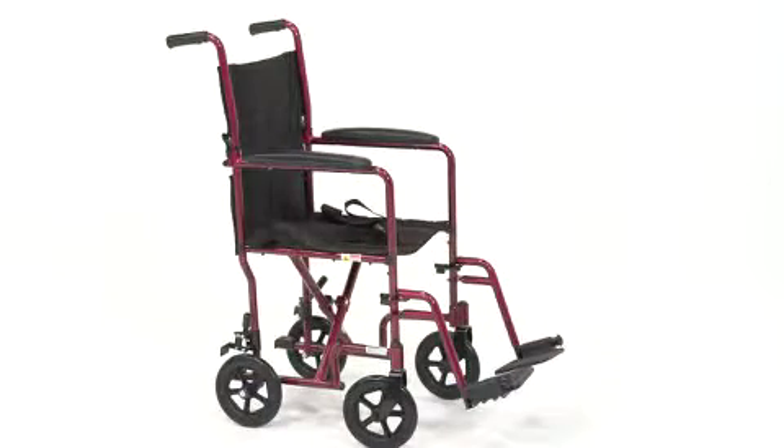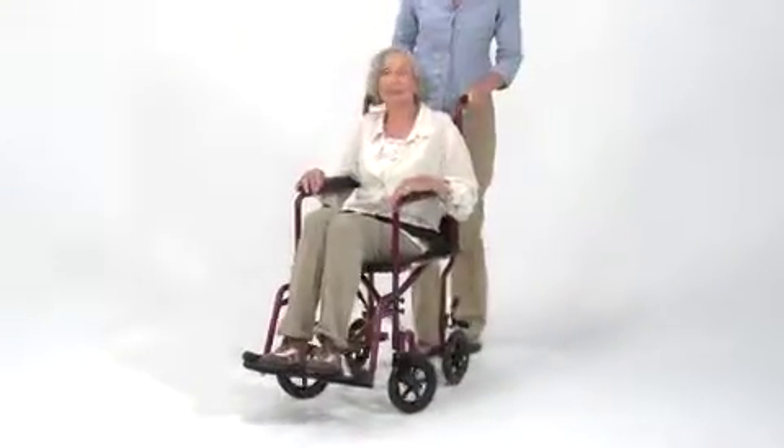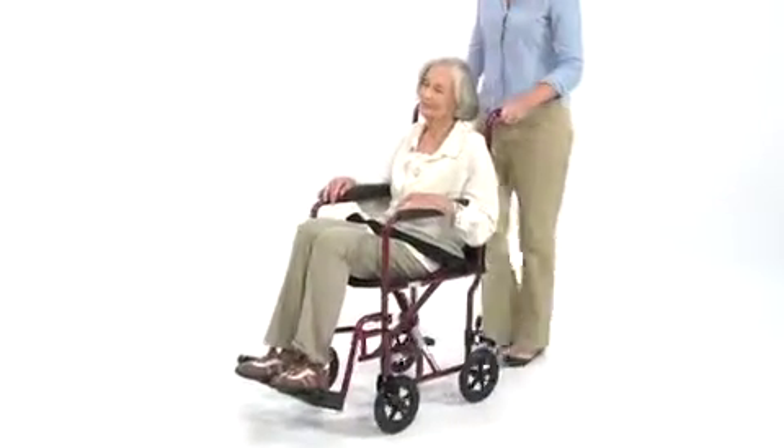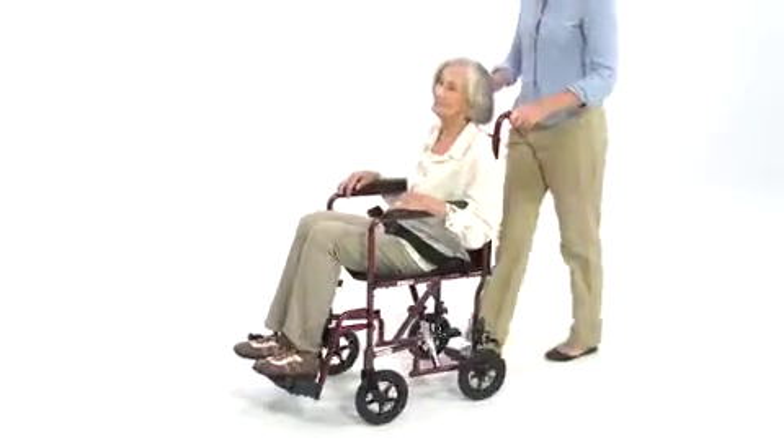The chair's strong aluminum frame and durable material supports up to 300 pounds, and the seat width is available in both 17 inches and 19 inches to accommodate different users. The armrests are padded for additional comfort.